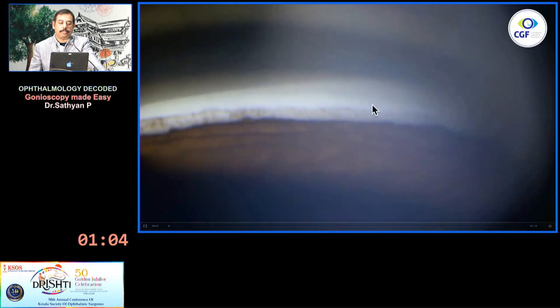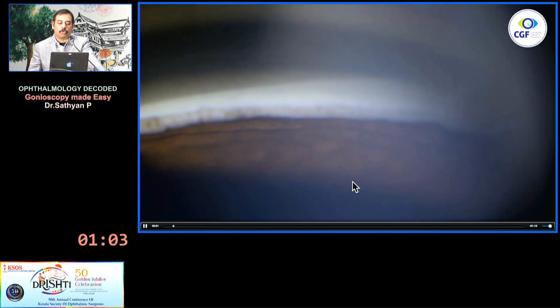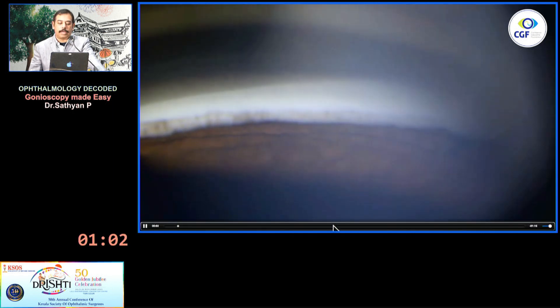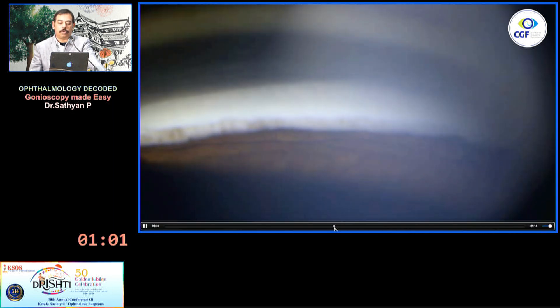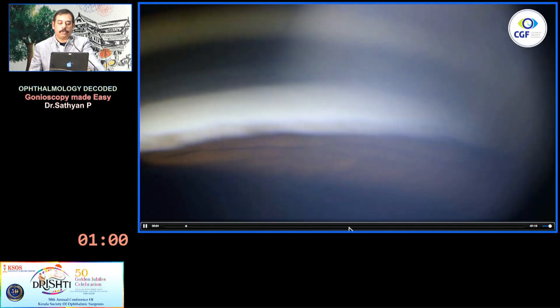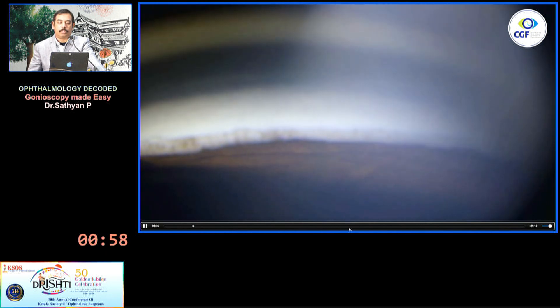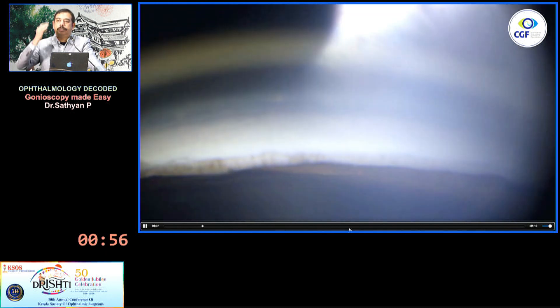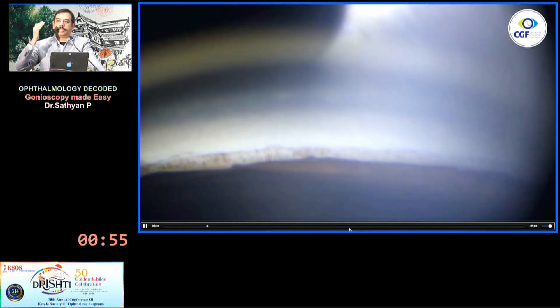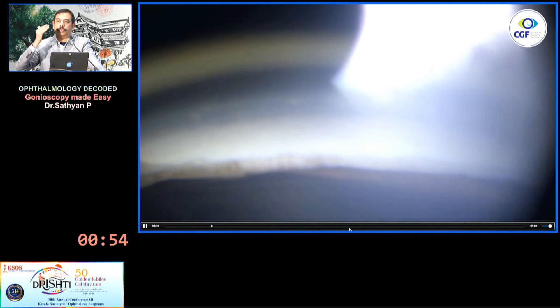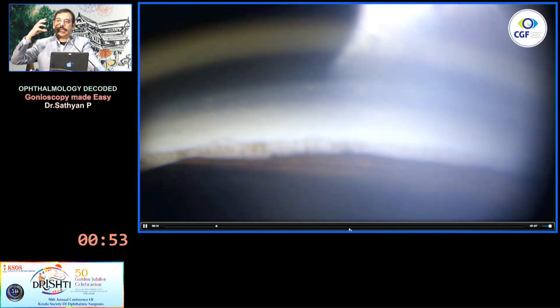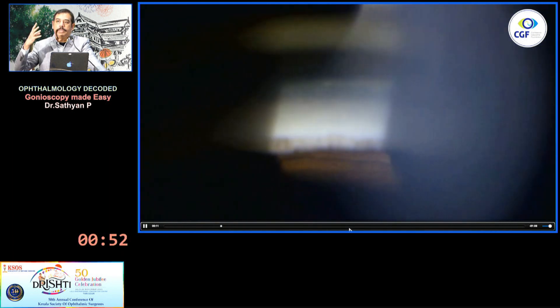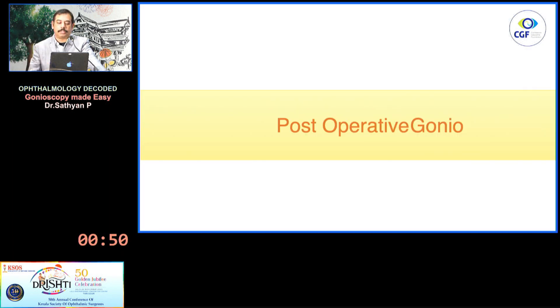Manipulation gonioscopy: when you ask the patient to look up, you can see the angle widen. When you ask the patient to look towards the mirror, the angle opens up a little bit. This is called manipulation gonioscopy.